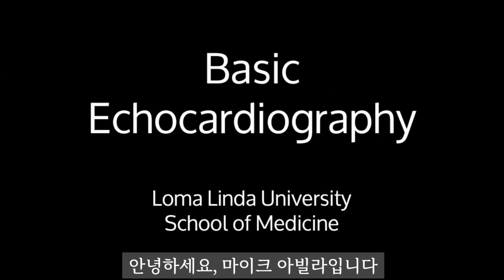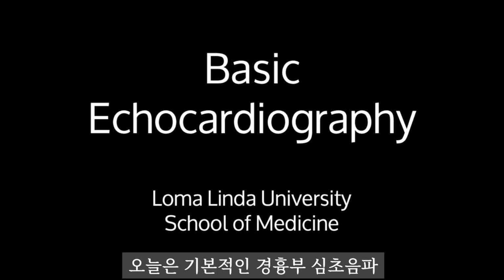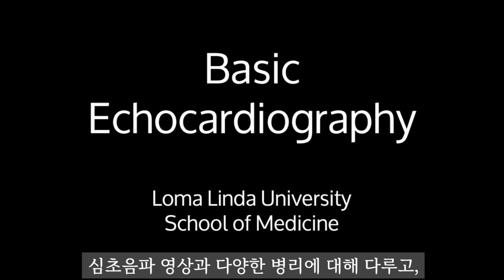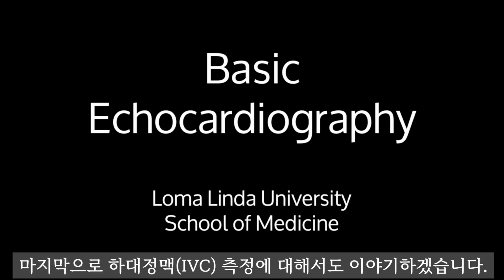Hi, my name is Mike Avila, and today we will be talking about basic transthoracic echocardiography, including the imaging windows and various pathologies. At the end, we will also talk about IVC measurements.